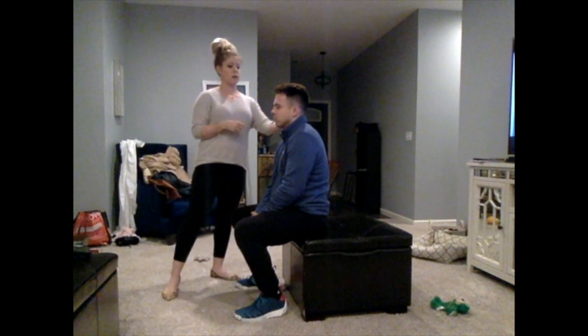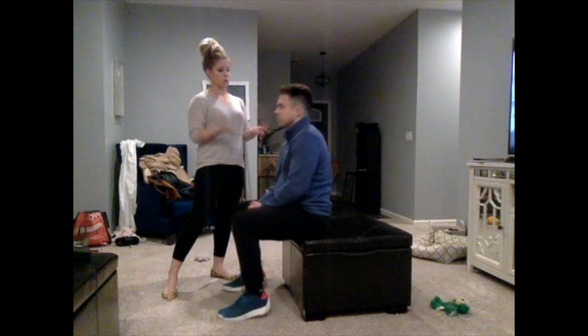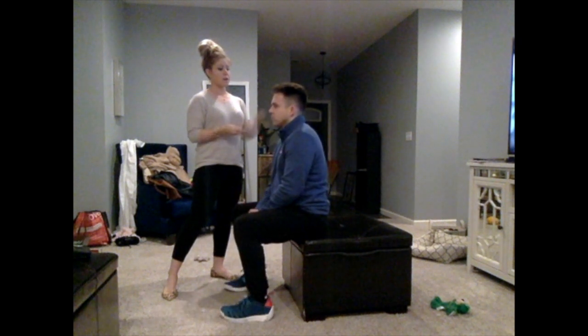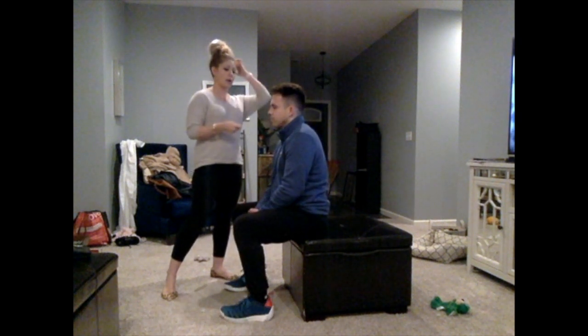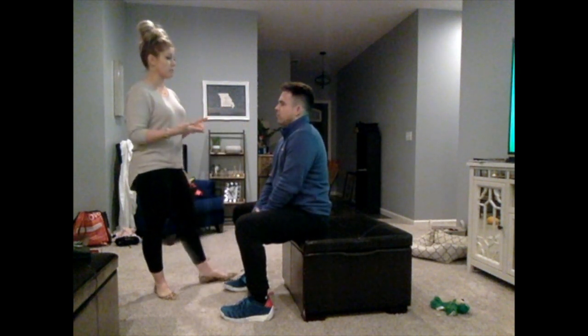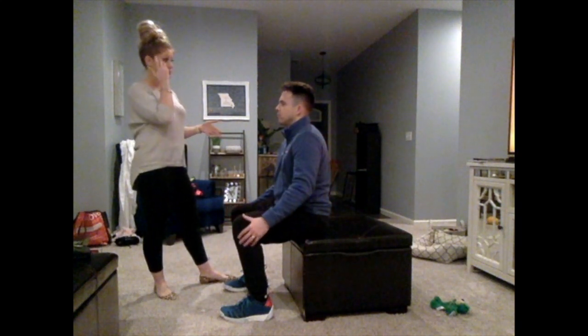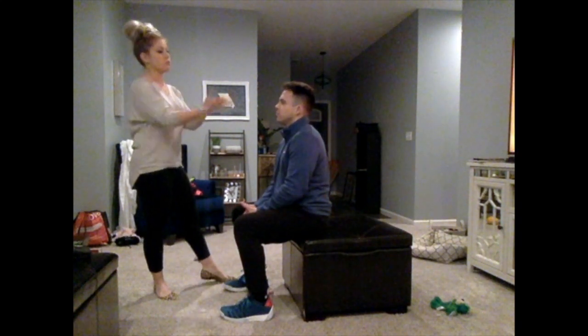Then I would do the Rinne test, and I would strike the tuning fork and I'd place it on the back of the ear on the mastoid bone, and I would ask you to tell me when you stopped hearing it or feeling it. Then I'd place it in front of your ear and I would ask if you could hear it. And if you did, that's what we would want, because air conductivity is greater than bone conductivity. So that would complete it, and then I would do it on the other ear. So that completes the ear test.